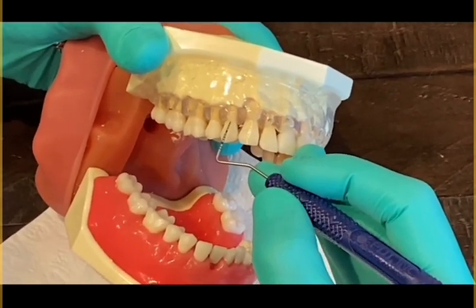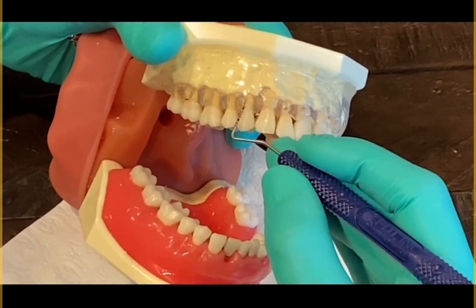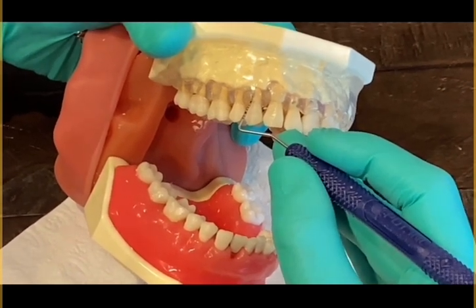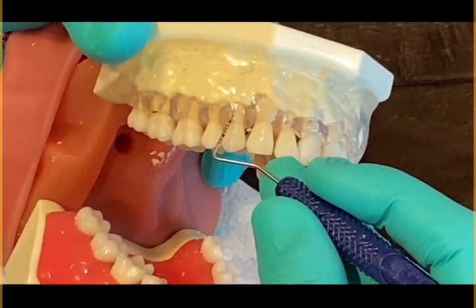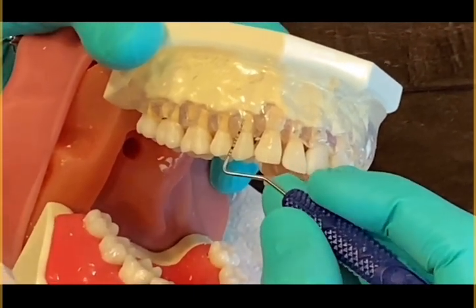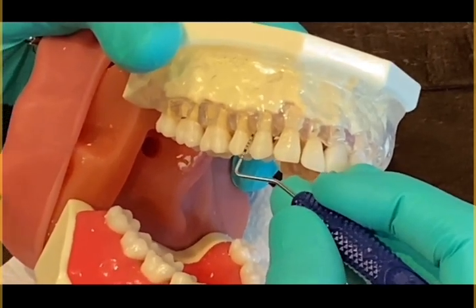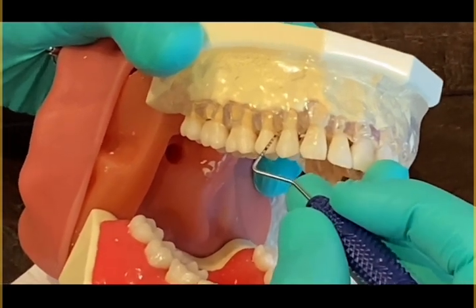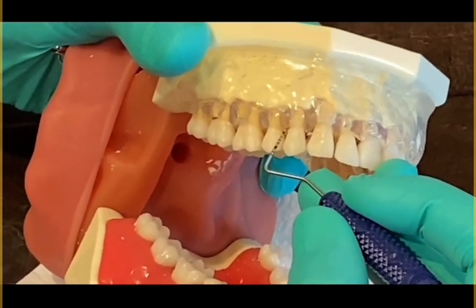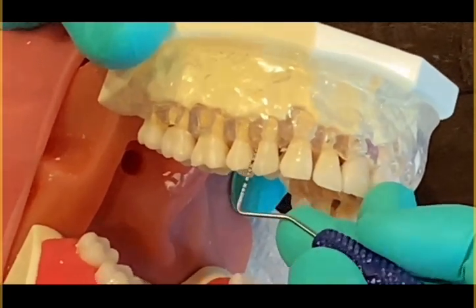When you are beginning, you want to insert the probe into the sulcus and have it pointed towards the apex of the tooth. You want it tilted away from the tooth so that it is in the sulcus. You do a walking motion from the distal line angle into proximal, and when you get into proximal, you tilt 10 to 15 degrees to get into the col space. This reading is 3 millimeters for this section of the tooth.